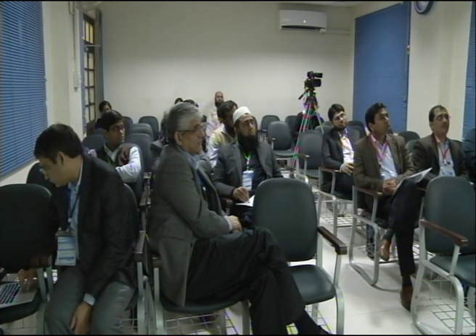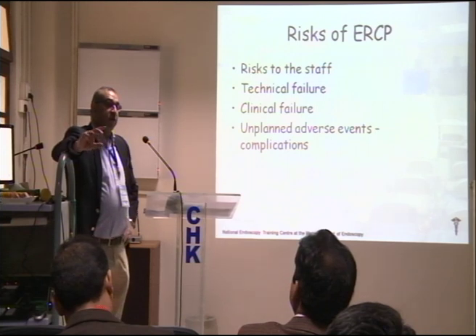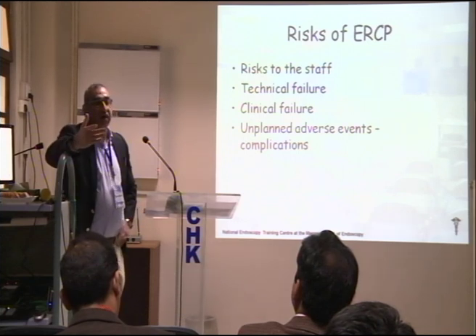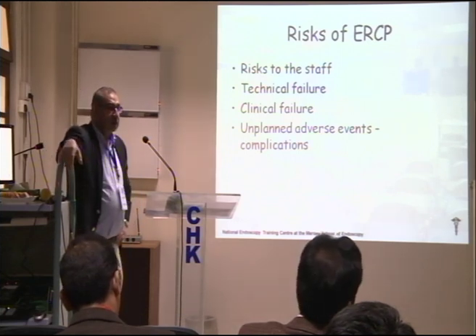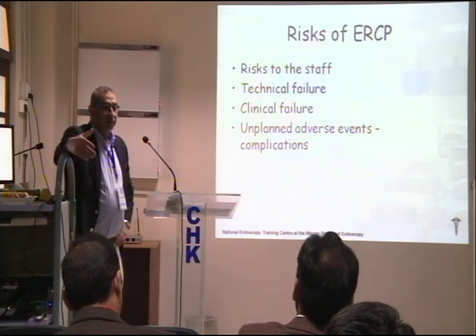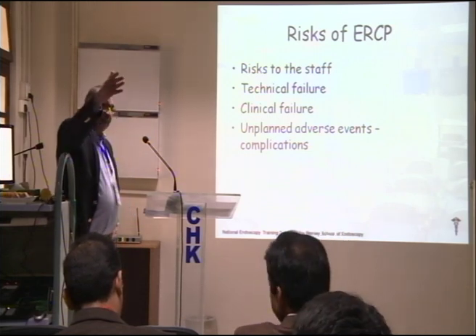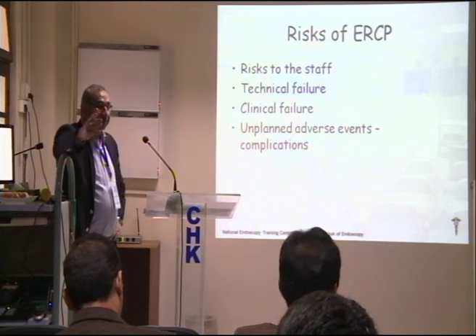वैसे मैंडेटरी फिगर जो है हमारा यूके में जो ट्रेनीज के लिए होता है, बिफोर दे आर अचीव्ड एज कॉम्पिटेंट और एबल टू डू इट इंडिपेंडेंटली, वो हम डॉप्स करते हैं, दैट वी ओनली डू आफ्टर 300 प्रोसीजर्स. What do you think is the average Pakistani figure for doing independent ERCP? I don't know. I think from what stories I hear, horror stories, वो तो 5-10 पे भी करते हैं, लेकिन क्योंकि तारिक महमूद, प्रोफेसर तारिक महमूद, 25 to 30.